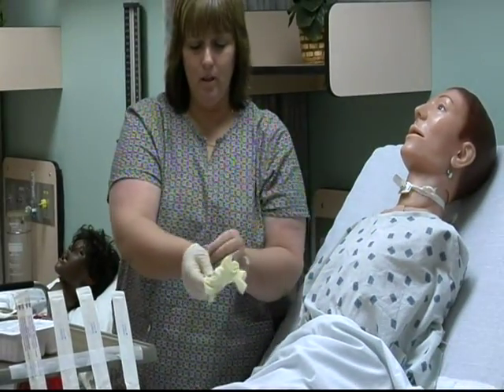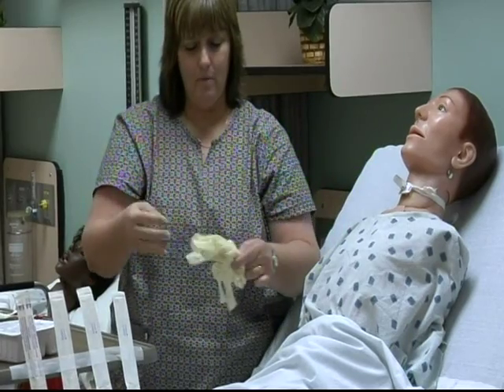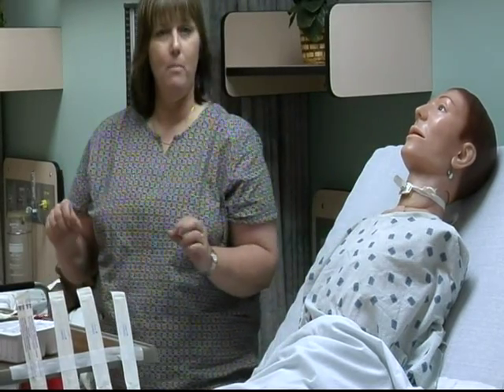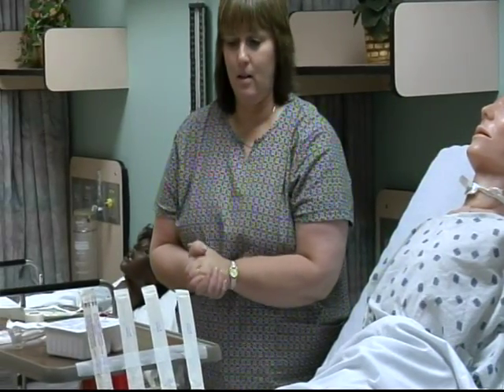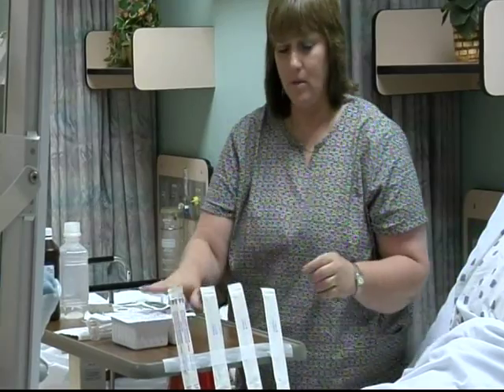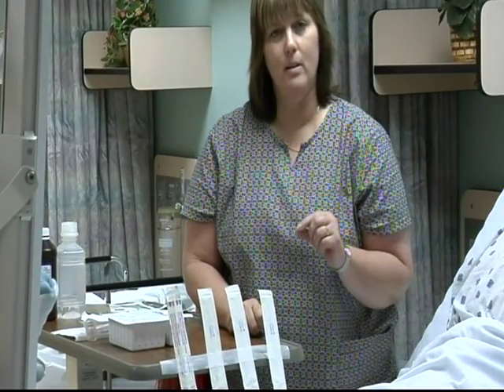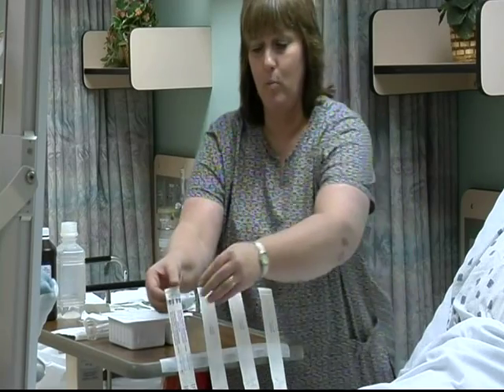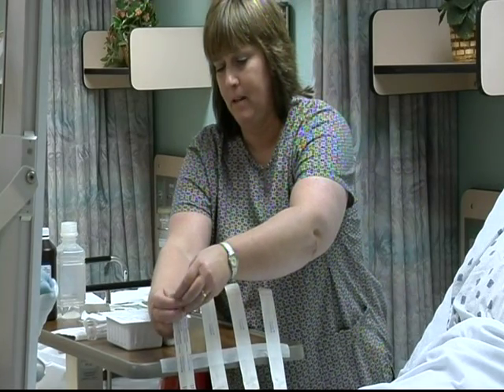Then remove your gloves as you were taught without getting the drainage on you. Throw it in your bio bag and then go wash your hands. All right, now we've got to open all our sterile supplies. So what I want you to do is open your Q-tips from the back so you will not contaminate them.